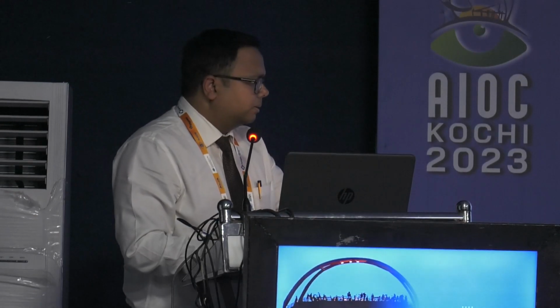Not to name any brands, but we are using the foldable multi-piece IOL of a very high quality brand, and in the majority of cases we are using those particular lenses only. In very rare cases where the patient cannot afford it, we can also place a rigid IOL. I have placed rigid IOLs, but only once in a while. Say if I am performing 50 surgeries with foldable IOLs, maybe 2 of the patients have a rigid IOL. But it's easier to use a multi-piece foldable IOL.